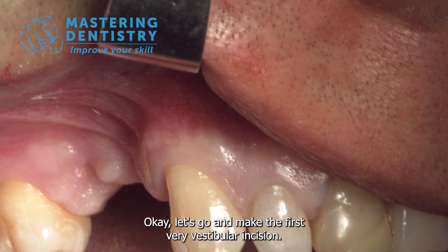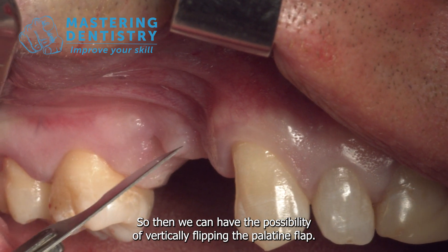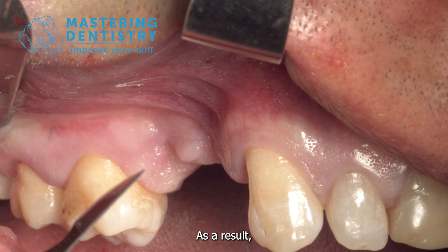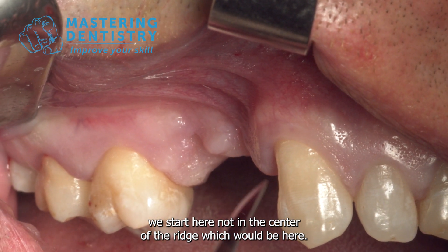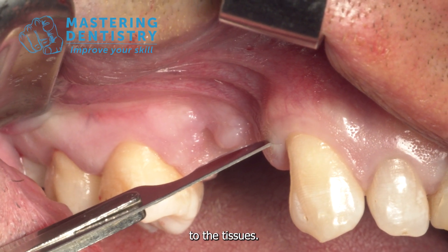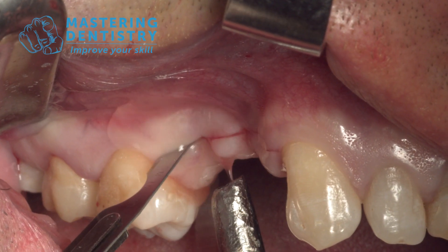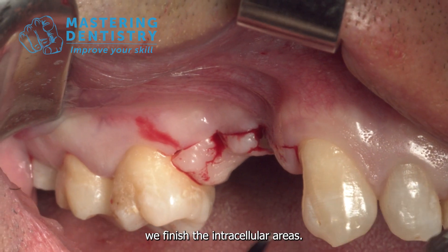Let's make the first vestibular incision so we have the possibility of vertically flipping the palatine flap, allowing us to move the vestibular flap as much as we wish. We start here — not in the center of the ridge — and make an incision perpendicular to the tissues. In this way we finish the intrasulcular areas.